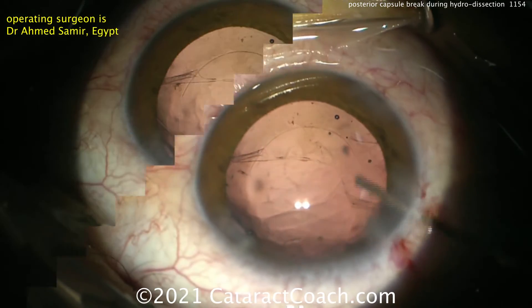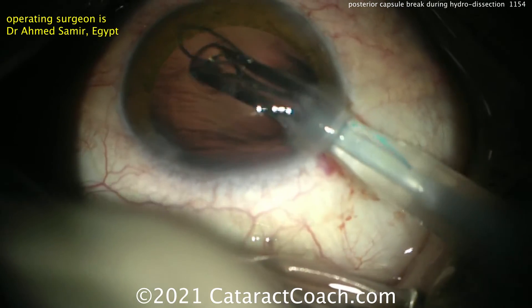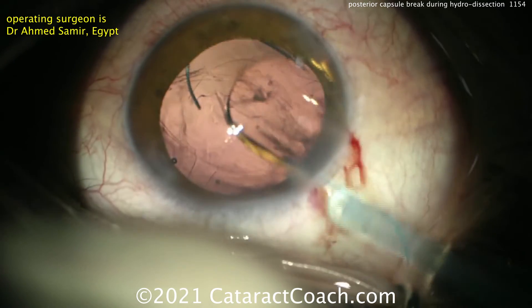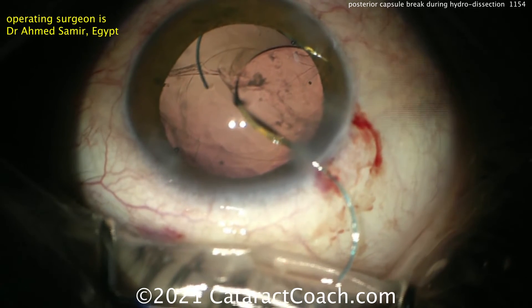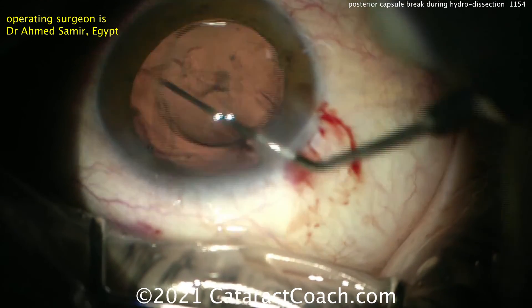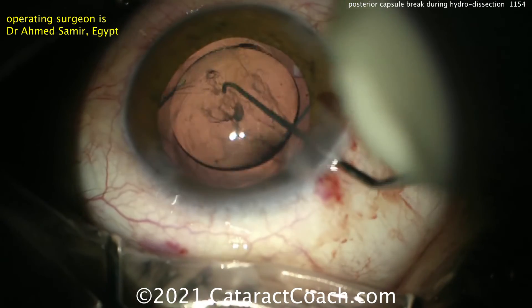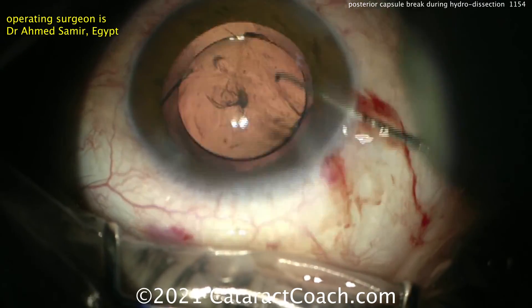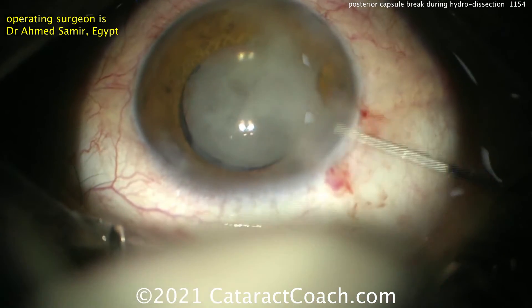Now we can see the extent of the break. Look at the anterior capsular rim — it looks like it did radialize. Here comes the lens going inside the eye. It's a three-piece acrylic lens, nicely put in the eye. Get that dialed into position and get that trailing haptic flipped over to the correct orientation. You can put these haptics in the sulcus, orient them 90 degrees away from any of those anterior capsule breaks, then tuck the optic through the capsulorexis — this should do very well long-term.